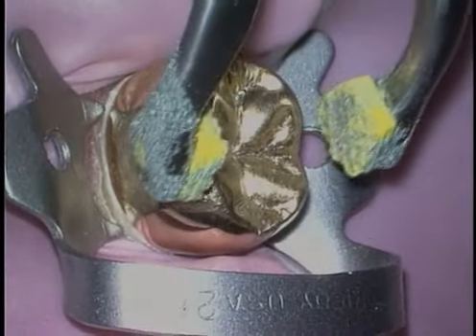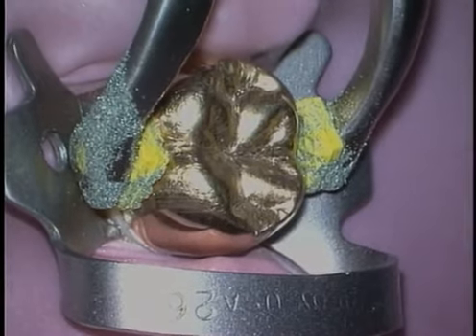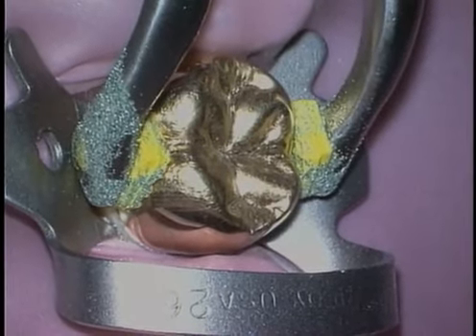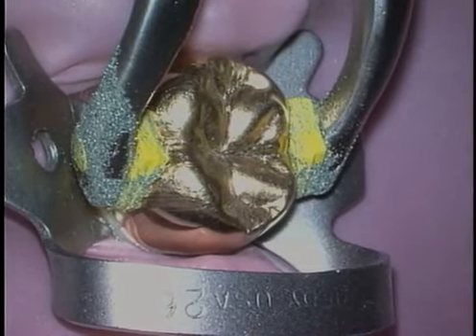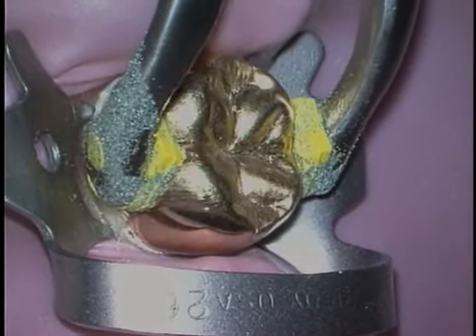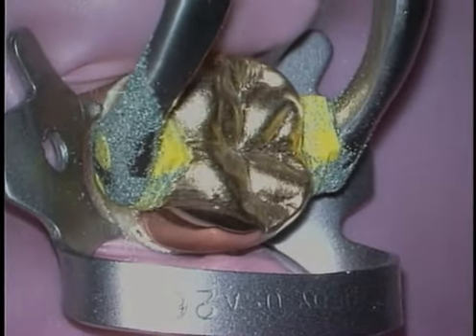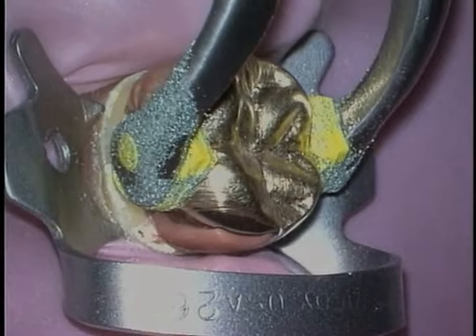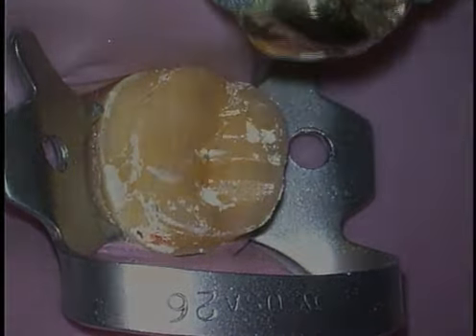Ideally, the jaws of the instrument are placed below the heights of contour on the buccal and lingual surfaces of the restorative. Squeeze the handles of the plier firmly, and then use gentle micro movements and progressively rock the restoration buccal to lingual. Repeated and controlled movements break the luting agent between the tooth and the restorative.